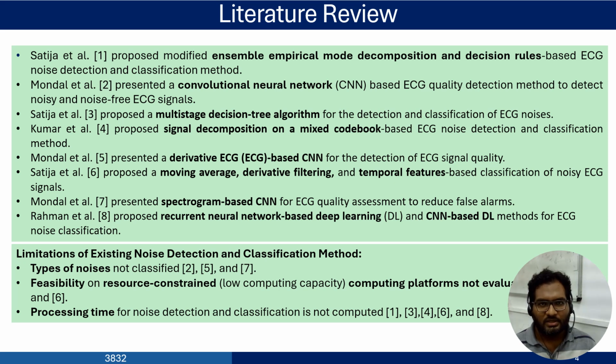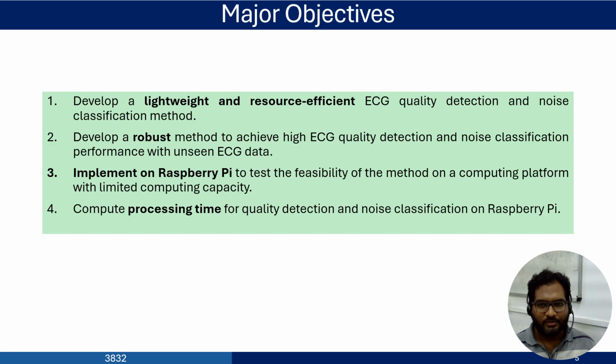But the existing literature has limitations: a few of them have not detected or classified the type of noises present in the ECG signal. The feasibility on a resource constrained platform of the existing methods is not evaluated. The processing time for noise detection and ECG quality assessment is not computed.